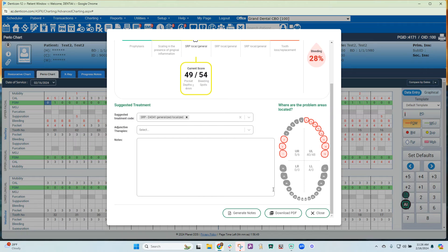Then on the odontogram, this shows the patient areas of concern. Any tooth that's red means that there's bleeding. It divides the mouth into quadrants and gives you a ratio of pocket depths greater than or equal to 4 millimeters over bleeding spots for each quadrant.